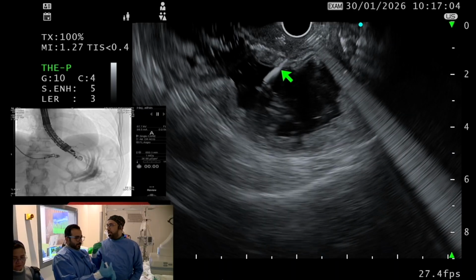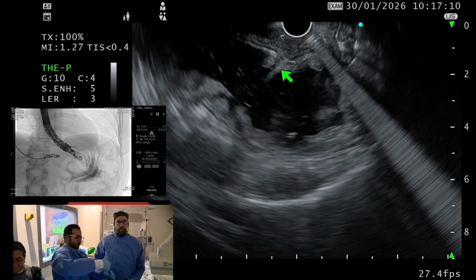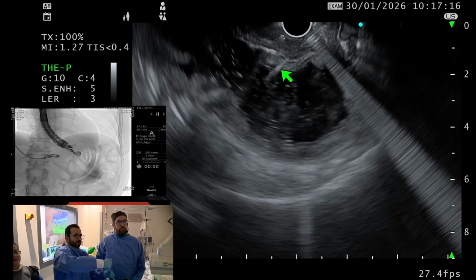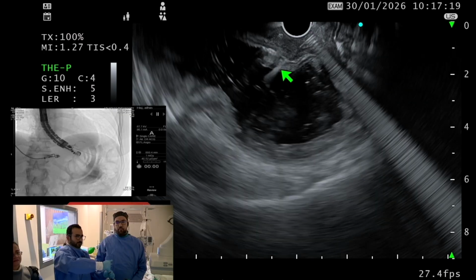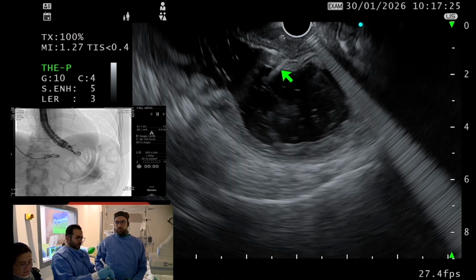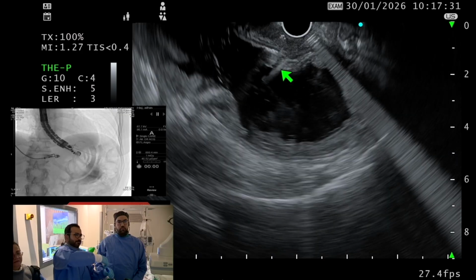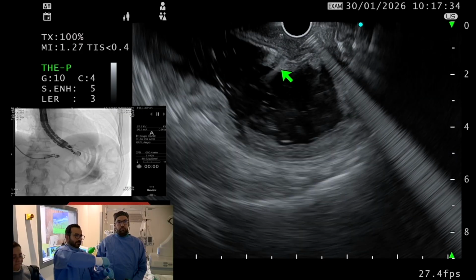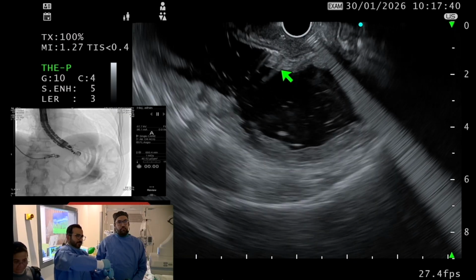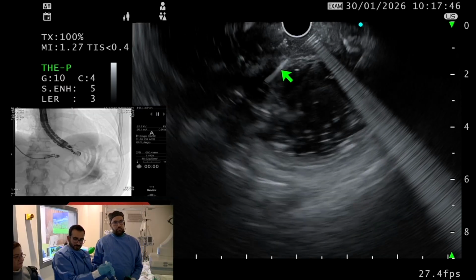So we may need to come back again and put a stent. In that case, it's very difficult and very risky to go laparoscopic every time. So I think EDGE has the advantage here. There's also the issue of organization and time consumption. I did a case last week in a patient with a gastric bypass, same story, needing a cholecystectomy and CBD stone, but they don't have EUS. So I had to do it through surgery, through a gastrostomy site, and then do the ERCP. The problem with that is arranging the OR time for you and the surgeon as well. We spent almost an hour and a half to 2 hours adjusting the gastrostomy site and angle. With EDGE, hopefully it takes less than 20 to 25 minutes. So time is a factor.